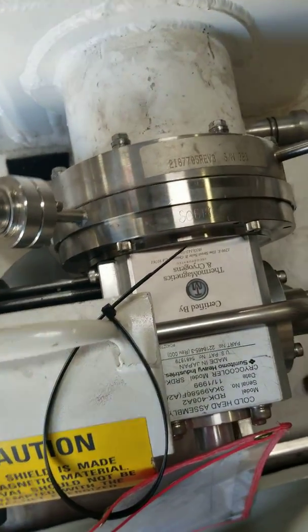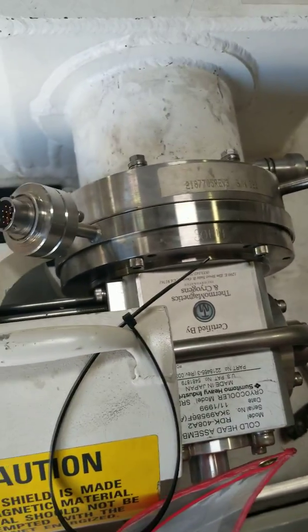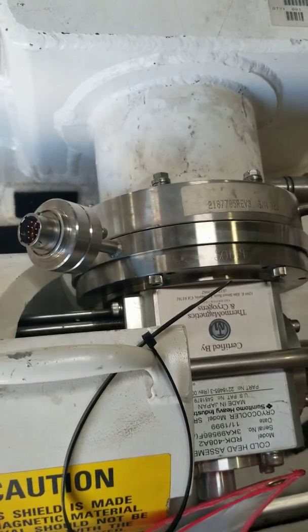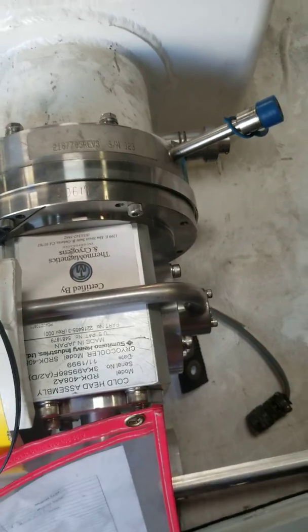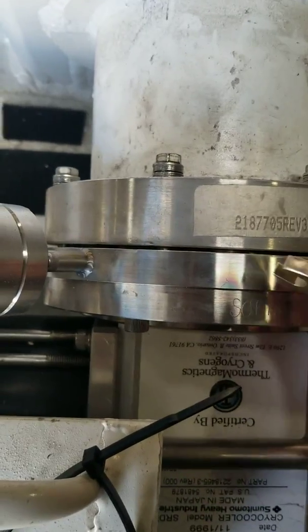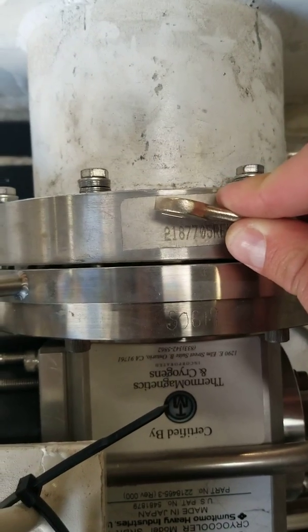This is a video on how to evaluate a cold head on a GE 1.5T MRI. So this is the cold head. This is where the cold head meets the flange.